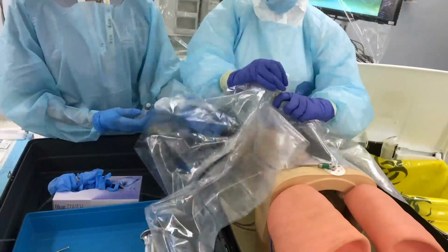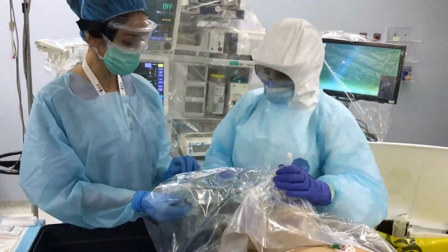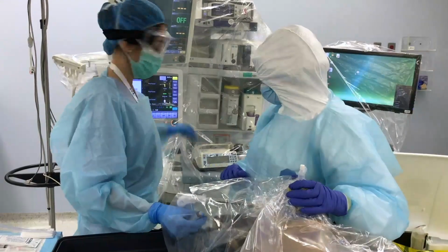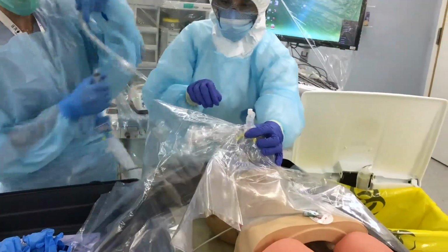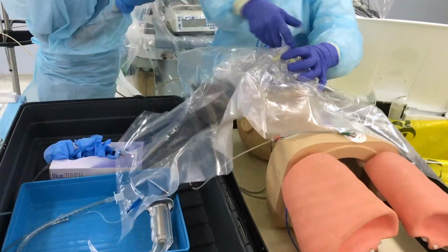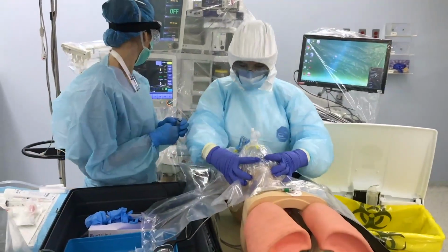So once we're ready to extubate, we're going to pause the gas flow, remove the breathing tube, and then reapply the face mask. Okay? Yes. So now that the patient is ready, we're just going to pause the gas flow. I'm deflating the cuff. I'm going to extubate and put the tube in the disposal bin while I give you the circuit to reconnect. And then we're going to resume the gas flow. Okay. The patient is breathing okay.